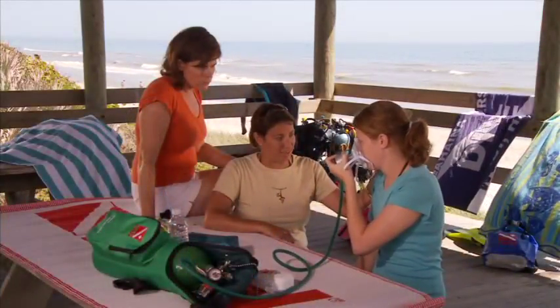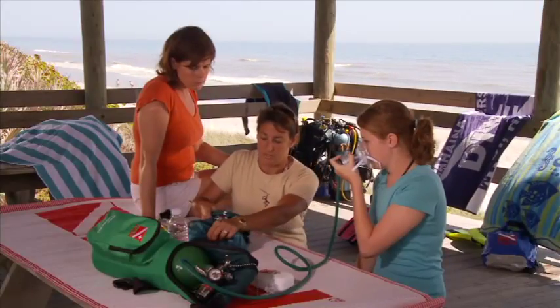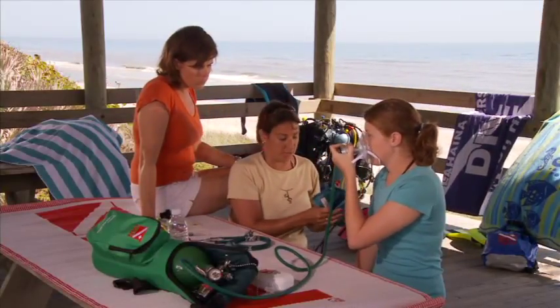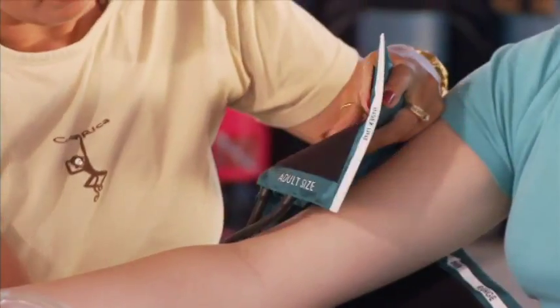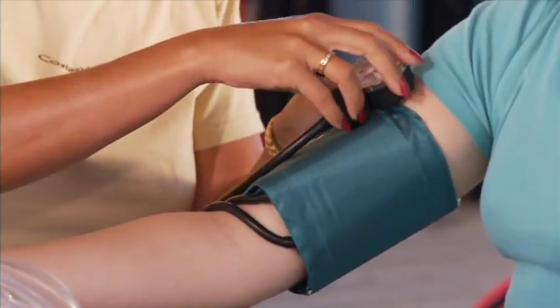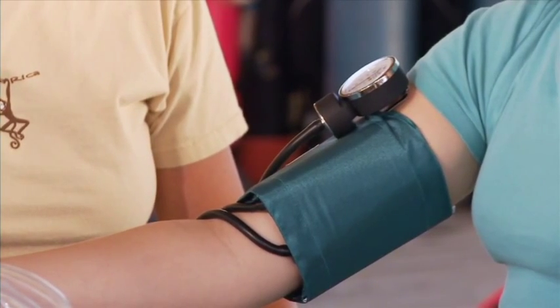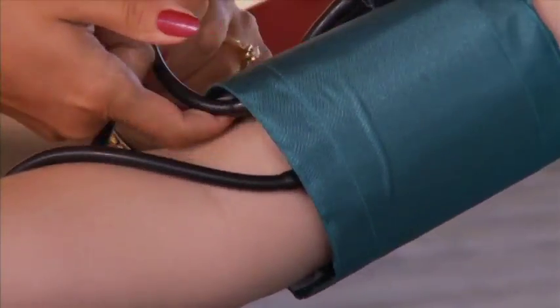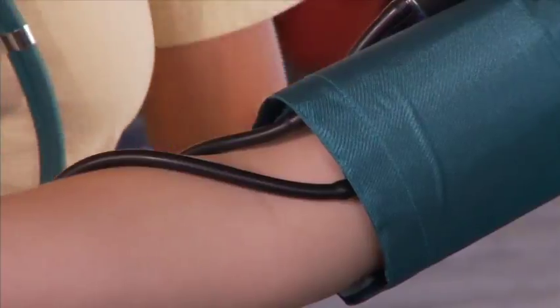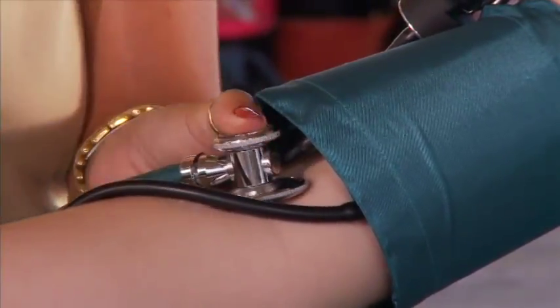I'm going to go ahead and take your blood pressure, just to make sure you're doing okay after that dive. Keep breathing that oxygen. To begin, make sure you have the proper blood pressure cuff. It should wrap around the diver's bare upper arm about an inch over the antecubital space in front of the inside of the elbow, and should cover about two-thirds of the upper arm. Many cuffs will have an arrow that points at the brachial artery. The cuff should be snug, but you should still be able to fit a finger under the bottom edge. Apply the stethoscope to the brachial pulse in the antecubital space, holding the diaphragm against the arm with your thumb or fingers.